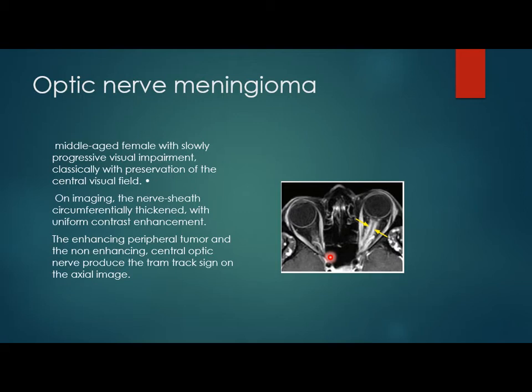Yes. Other points to differentiate between optic nerve meningioma and glioma: the tortuosity of the nerve goes with optic nerve glioma. Second, calcification. If we see calcification, it goes with meningioma. Third, enhancement, as Dr. Rashid said, there is enhancement of the optic nerve meningioma, while in glioma there is minimal or no enhancement. Yes, thank you.